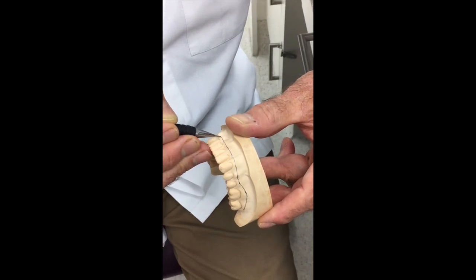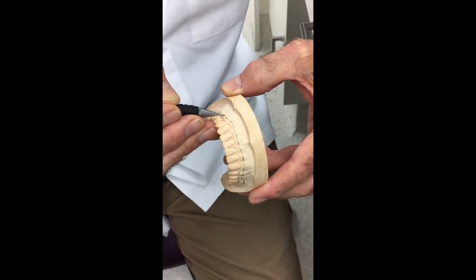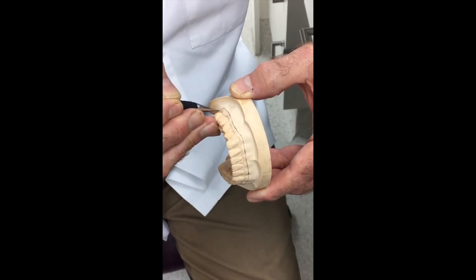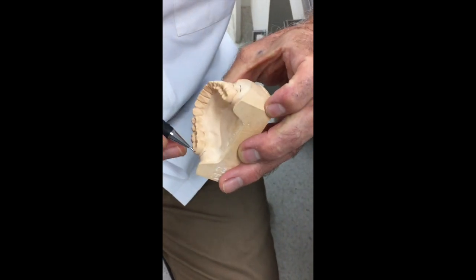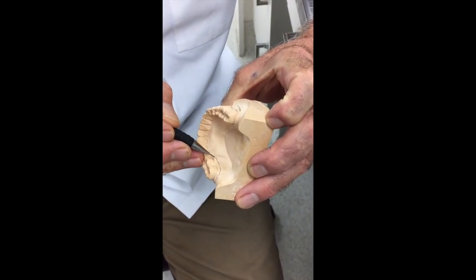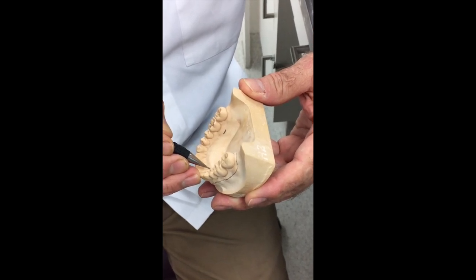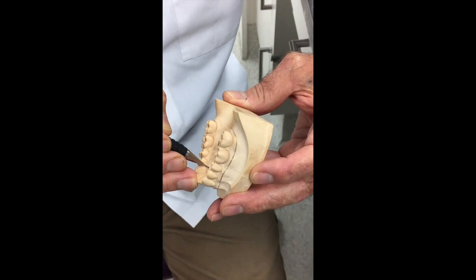Okay, so it's just a little bit below that distance when we get to the preparation, but everywhere else is just going over the gingiva by about this much. So that way we get this tray to actually guide itself into position over the teeth, because it's going down that small amount over the gingiva. When we place it in the mouth, it's going to guide itself down, and you'll see the reason why that's significant in a moment when we're placing the tissue stops to which we, the distance we will seat the tray.